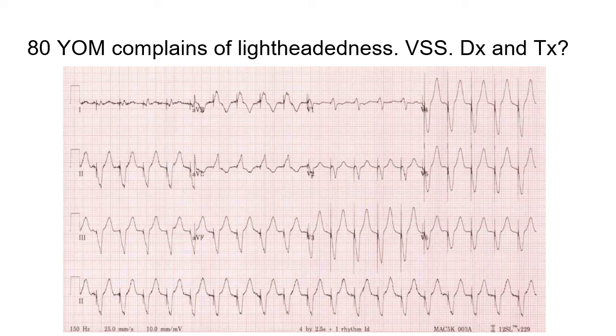Pacemaker. Yeah, he's got a pacemaker too, right? We've got pacer spikes. So this is a pacemaker-mediated tachycardia. If you see a patient like this, then we want to apply a magnet because the pacemaker is going too fast. A magnet resets it to its baseline settings of 60.